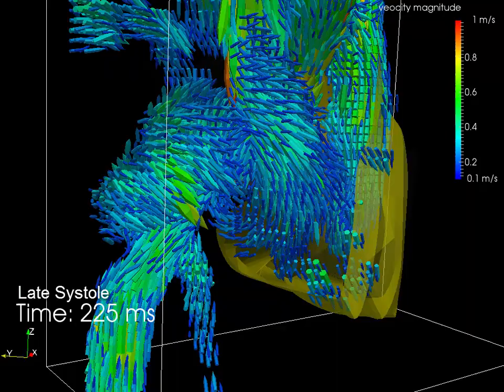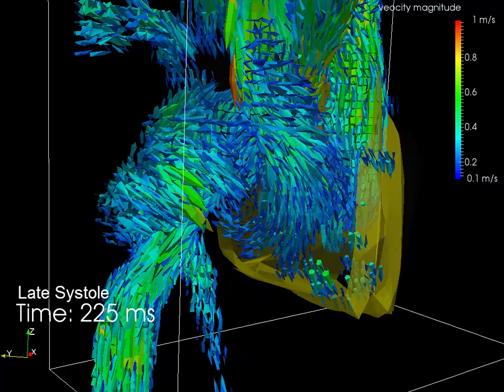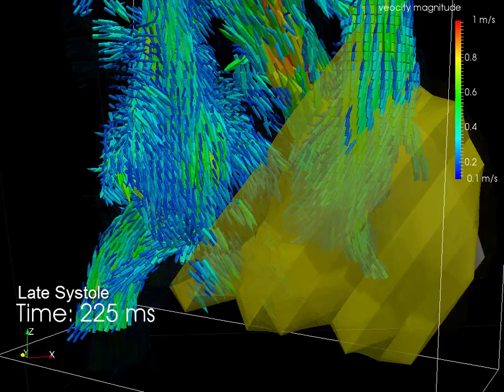Let's fade out the right atrium. Now we can see flow from the superior vena cava coming down and mixing with the inferior vena cava flow in the atrium.